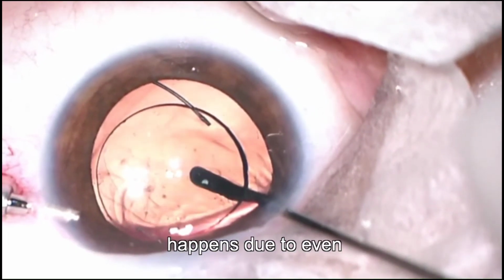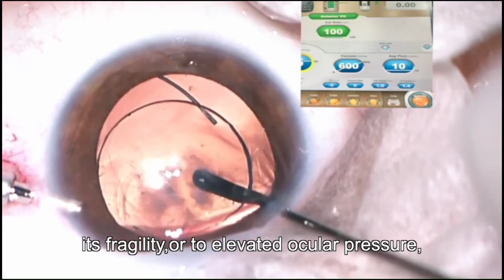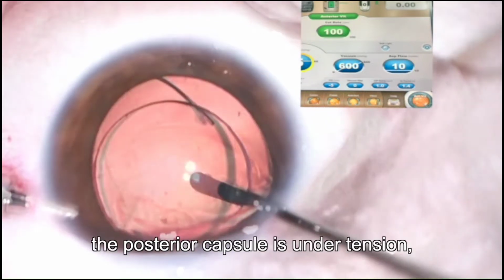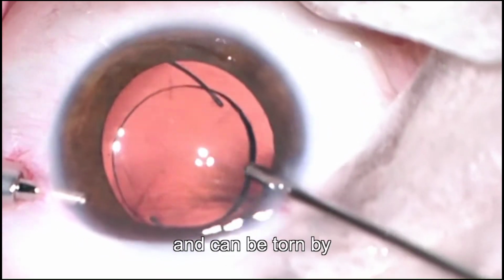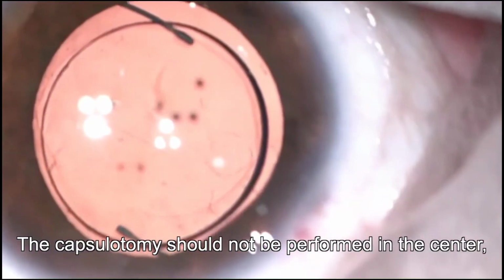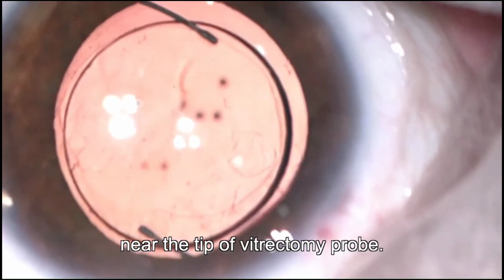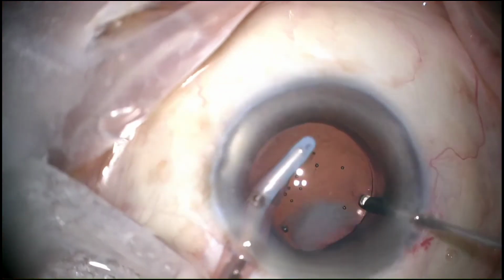In performing capsulotomy, the posterior capsule may rupture due to its fragility, or to elevated ocular pressure, or to the position of the vitrectomy probe. When the ocular pressure is high, the posterior capsule is under tension and can be torn by the cut of the vitrectomy probe itself. The capsulotomy should not be performed in the center, but in the periphery, near the tip of the vitrectomy probe.